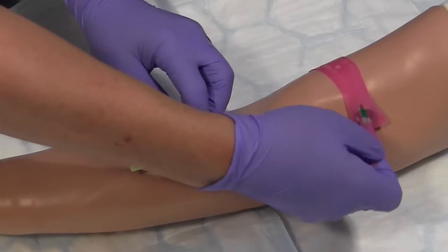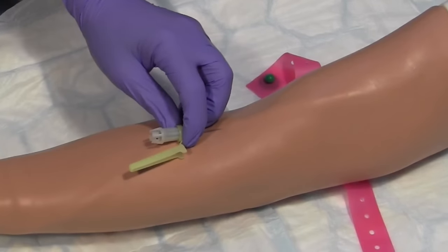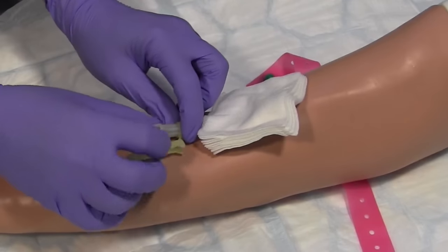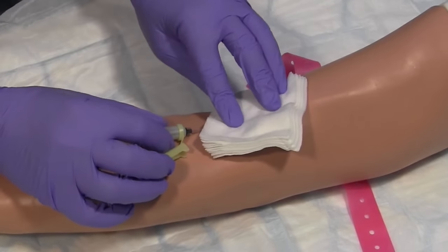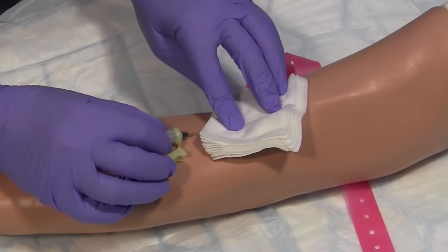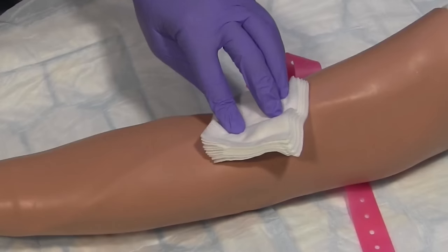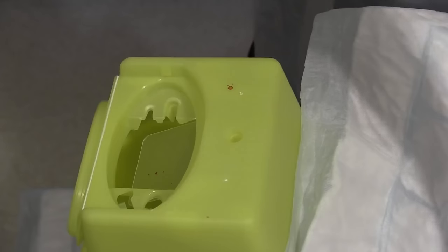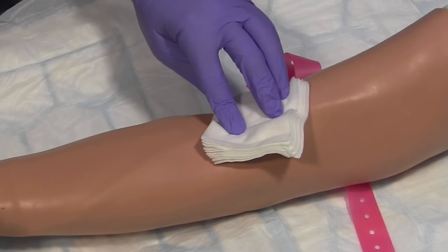Once you've filled your last sample bottle, release the tourniquet and place some gauze over the puncture site but don't put pressure on it yet. Remove the needle and only then press down with the gauze. Activate any sharp safety system before placing the needle straight in the sharps bin. In most cases applying pressure for about 5 minutes will prevent a haematoma from forming.